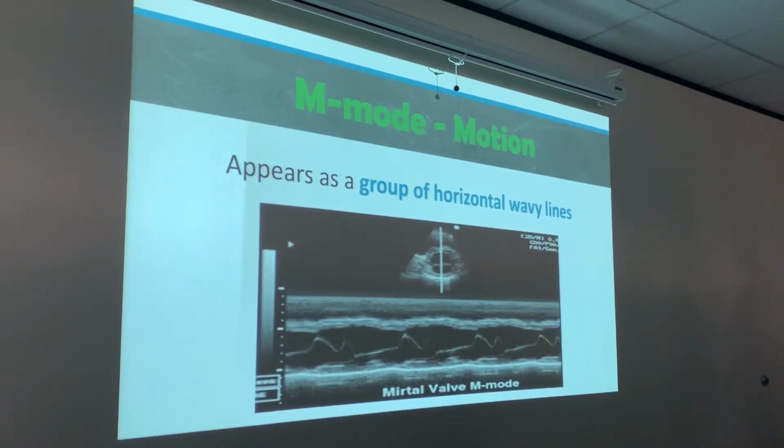And so when you change your speed to high, then you actually have to skip one of these, because it's also getting the heart pump and the release, and it's detecting both of those motions. So you have to skip one and just get the beat. So if I was measuring this, I put my calipers one right there and one right there. It doesn't matter as long as it's on the same place on the very next beat. Okay. So you just gotta find a place that's similar.